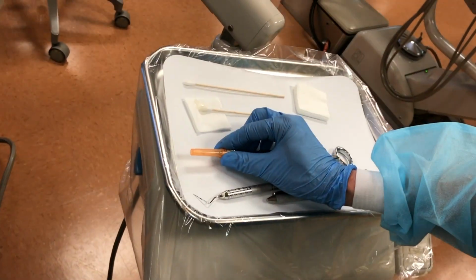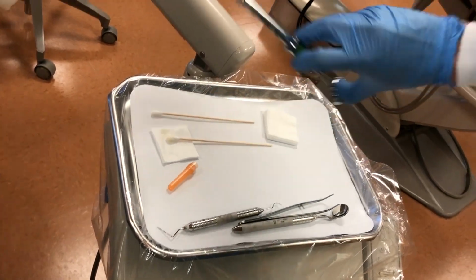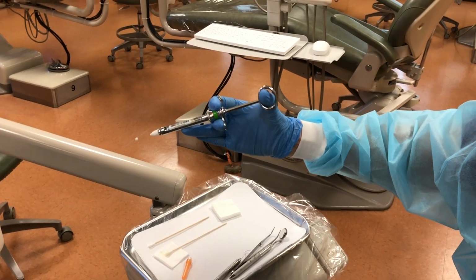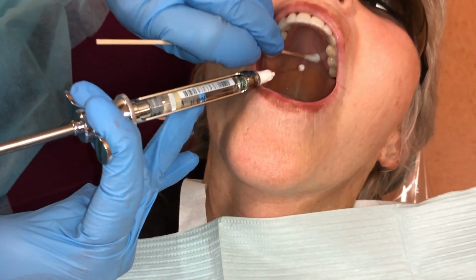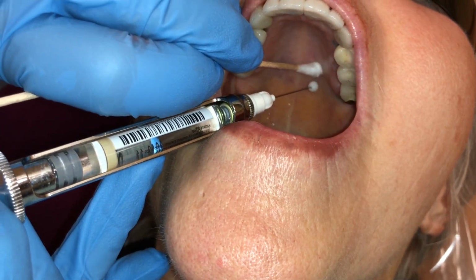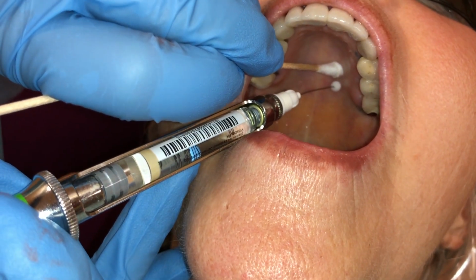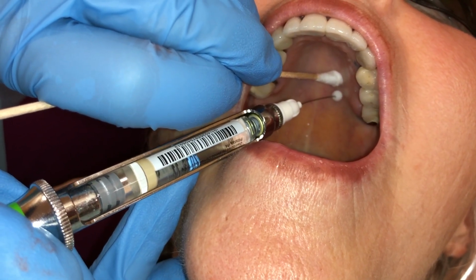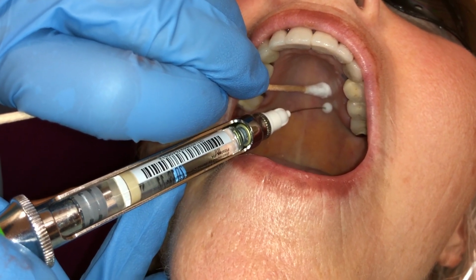Once the clinician has applied pressure anesthesia, uncapped the syringe, and achieved stability, the Q-tip can be rolled or slid out of the way to identify and penetrate the tissue at the appropriate location. It is best to keep pressure on the palate near the penetration location until blanching is seen.